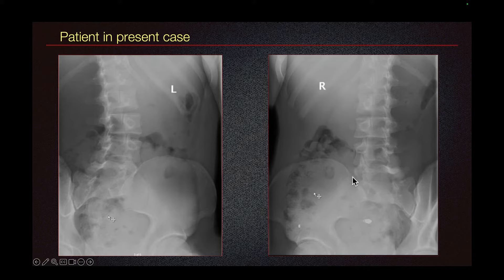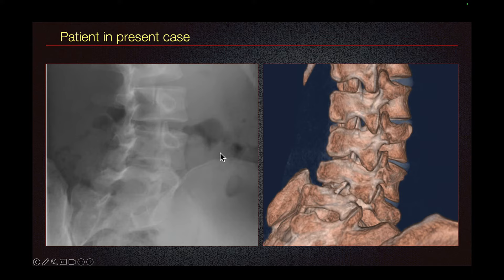Spine radiographs are insensitive for fractures. The appearance of posterior elements of the spine on an oblique spine radiograph is also called the scotty dog appearance. Let's learn about that anatomy in this 3D image generated from CT.